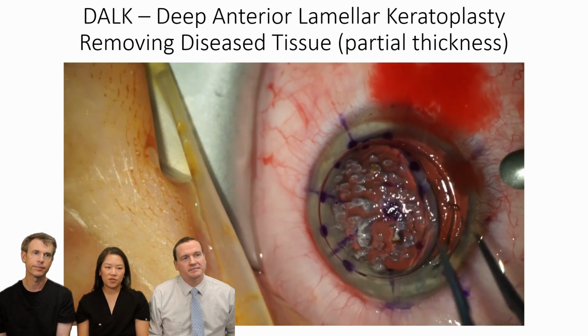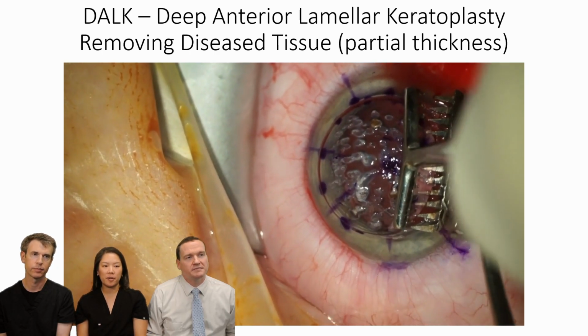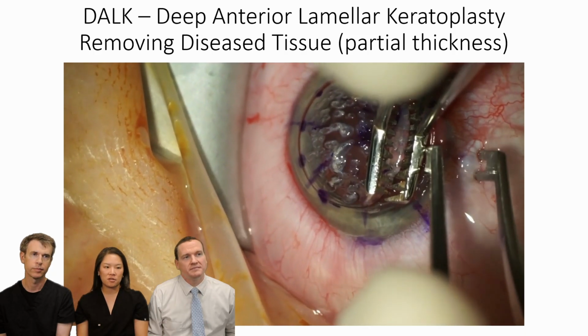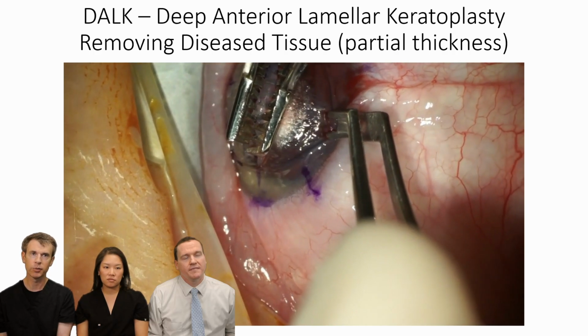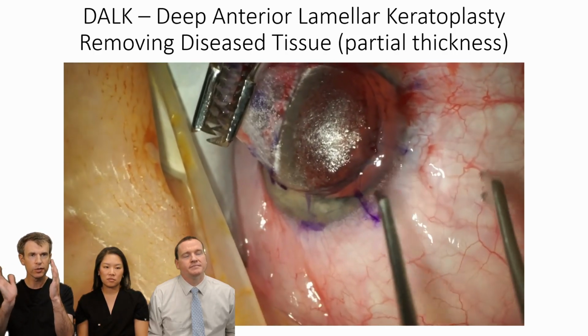There's different techniques for this as well. You probably have or haven't heard of Big Bubble. It's all kind of preference and situation. And this is a very difficult surgery. For me, it's still probably the most difficult corneal surgery I perform, and I'm still not always happy with my outcomes. But you can see the deeper you are on the cornea, the more easily the cornea separates.